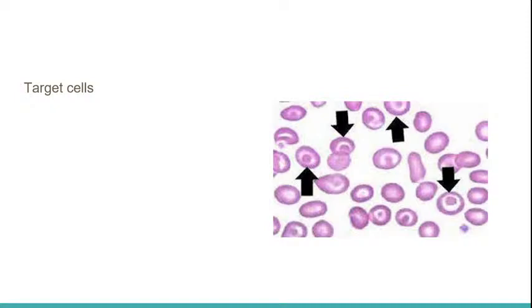Now, look closely at the sample that I've provided for you guys. This is taken from, I think, Central Texas College.